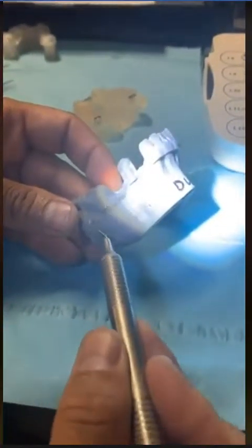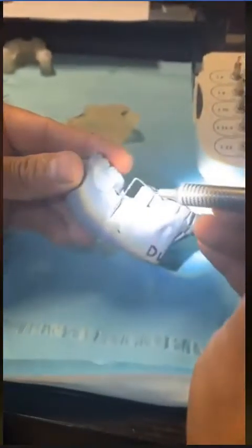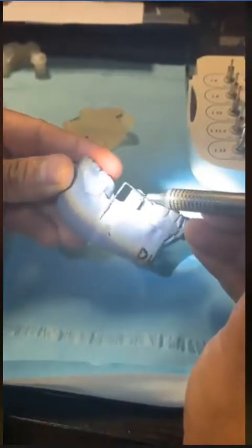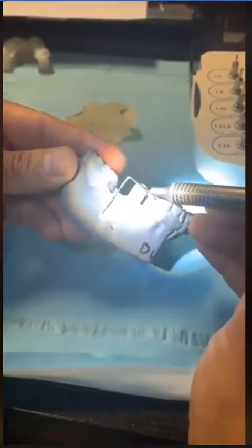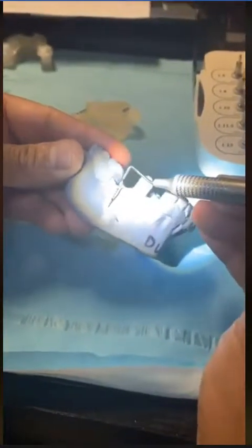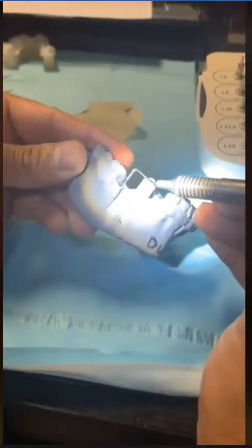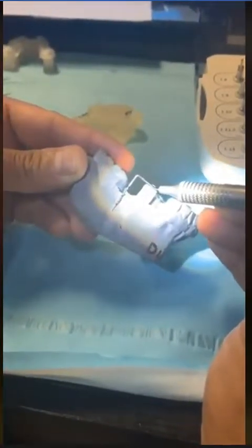So when you are looking at this, you have an ability to go as close to the mental as you possibly can, and I definitely recommend you stay 2 to 3 millimeters away from the nerve to be on the safe side. So in this particular case, if the mental is here, I know that the inferior alveolar nerve will not run above here, so I would just put the implant over here, and 10 millimeters would suffice in this particular case, and you'll be in good shape.